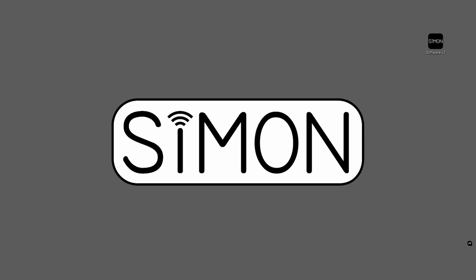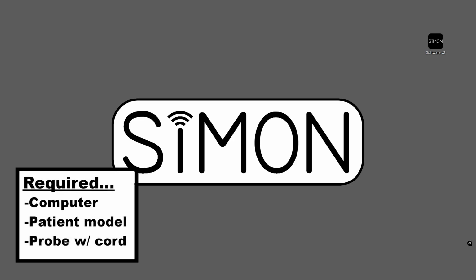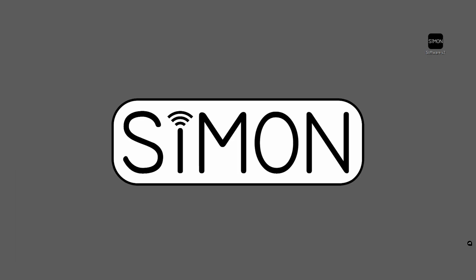Welcome to the SIMON Ultrasound Simulator tutorial. To start, make sure you have everything you need, which includes a computer, a patient model, and the SIMON Ultrasound probe with cord. Additionally, make sure you have downloaded the SIMON Ultrasound Simulator software from our website, and also be sure that you have downloaded any ultrasound videos that you wish to use with your simulator.